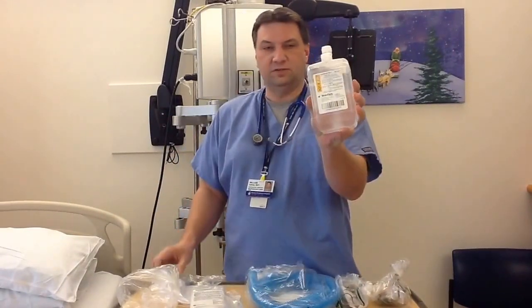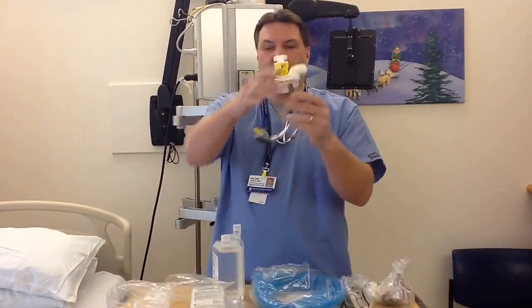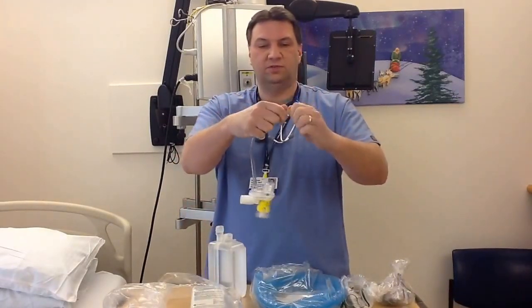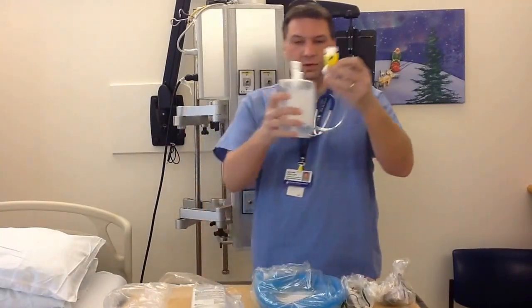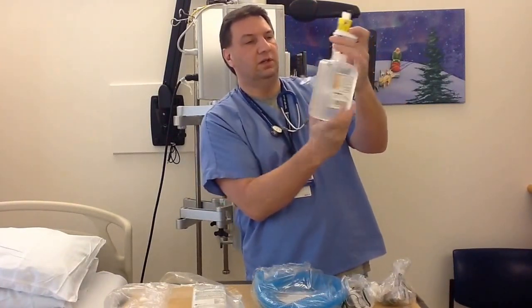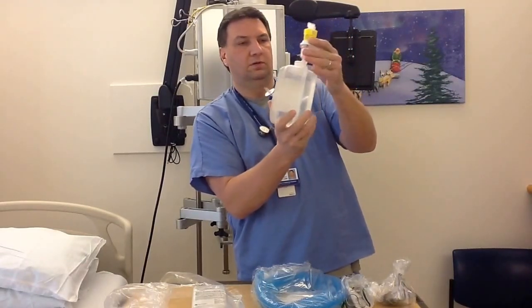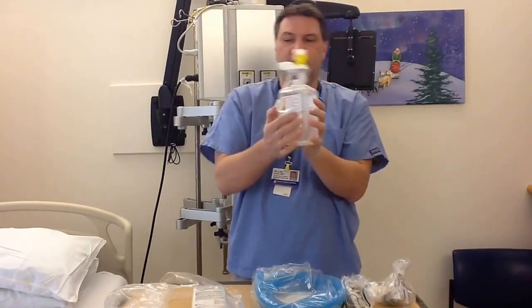The first one is this large nebulizer, and it's prepackaged with a holder like this that we have to connect to the water bottle. First thing we're going to do is take this yellow cap off, and we're going to insert the top part into the uppermost chamber. We're going to keep twisting it until it can't twist any farther, and it's going to look something similar to this.